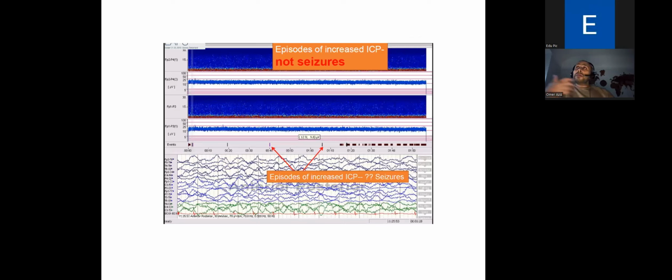As I was saying, sometimes we see some physiological changes in a child who has, for example, a traumatic brain injury that has come in, who has spikes in the ICP. And one of the questions always raised is, can this be seizure activity? And there's no way of actually telling because there's no other changes from that point. But if you've got the CFAM on, then you can say, actually, there's no generalized seizure activity, and you can be confident in that just by the use of CFAM.